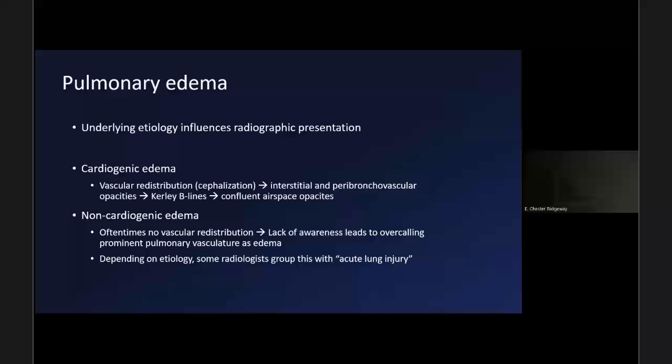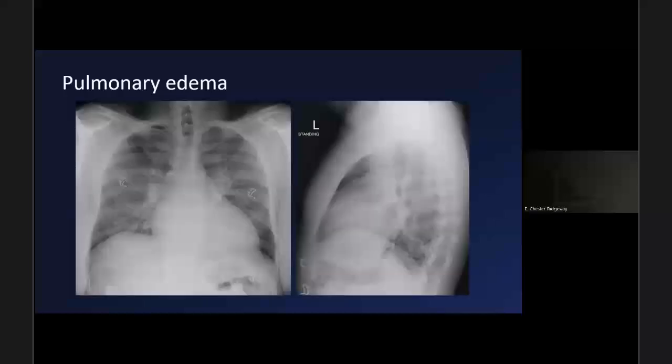Also for non-cardiogenic edema, depending on the etiology, some radiologists, like myself included, group it into acute lung injury because it's just part of that process, as opposed to a process that would require diuresing, for example. So lots of words, let's show pictures now.